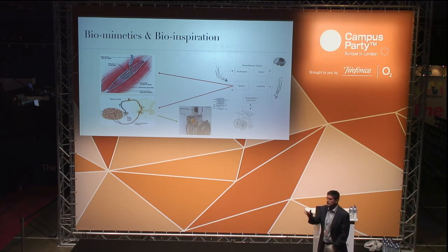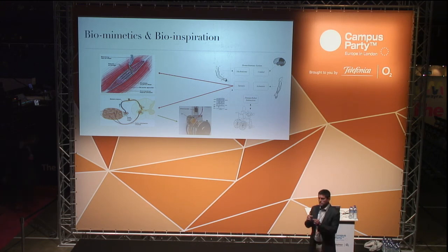So for instance, when we come to the sensory part of the exoskeleton that you will see, it is basically built and based on three types of sensors. We have force sensors, which measure the interaction force between the exoskeleton and the limbs. And then we have position sensors for the different joints and velocity sensors for the different joints.